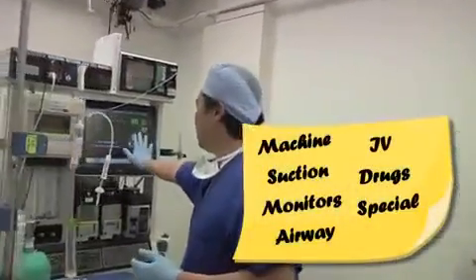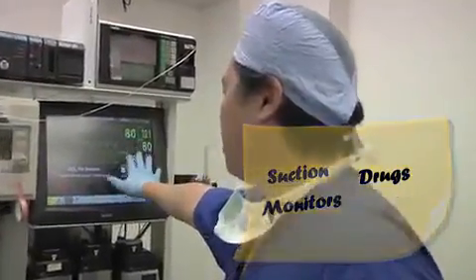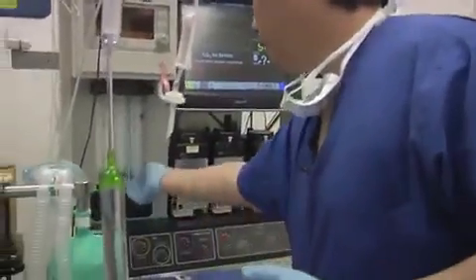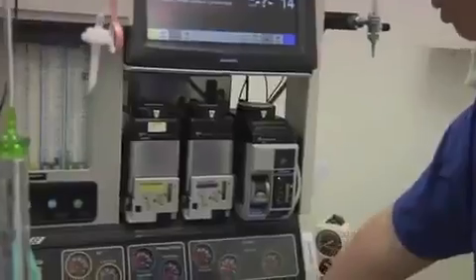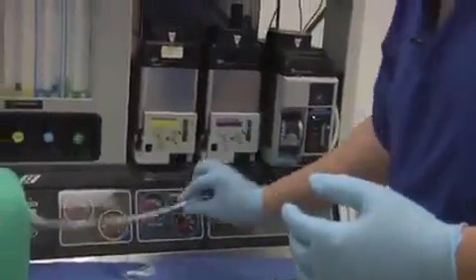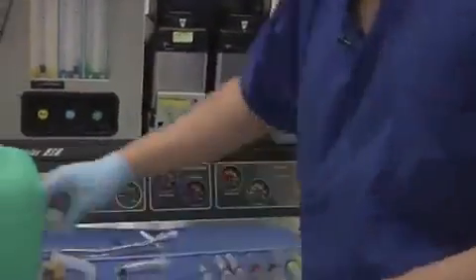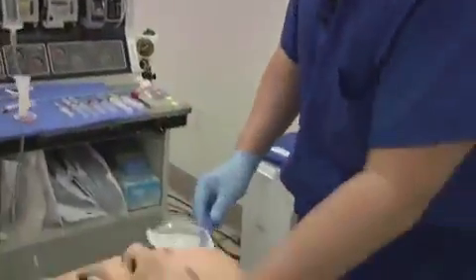here that your monitors are functioning properly, that you have your vital signs, your EKG, your pulse oximetry, and your blood pressure. You want to make sure that your oxygen is turned on because you're going to be pre-oxygenating, that you have all of your drugs here ready for use, your endotracheal tube is styleted and ready for placement, and that your laryngoscope blade is working. Again, you want to make sure that your suction is available and right here at the head of the bed.